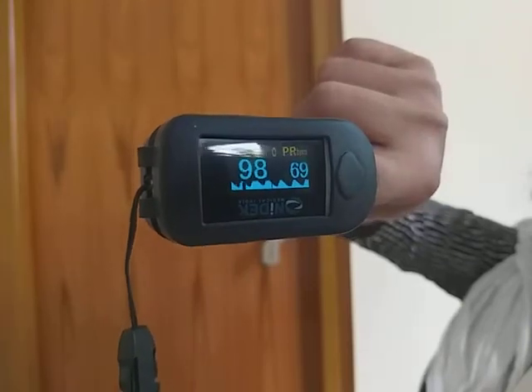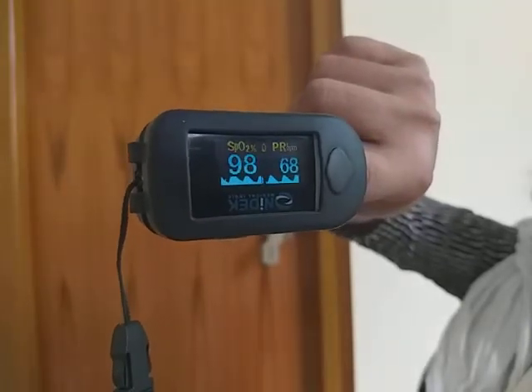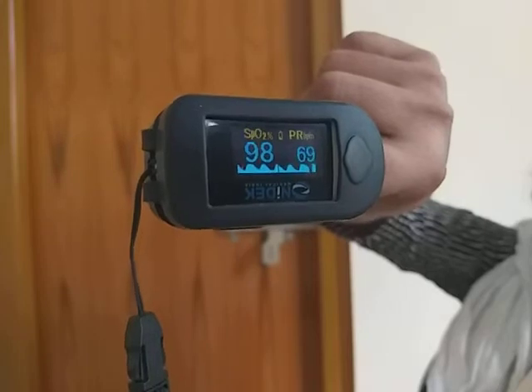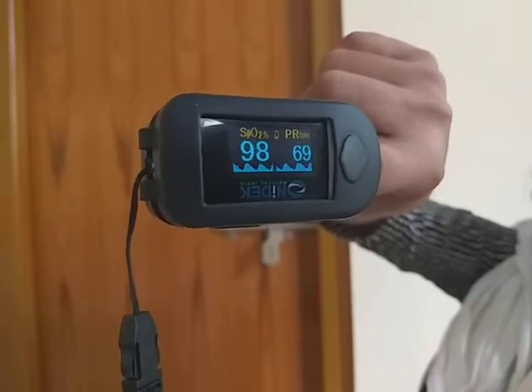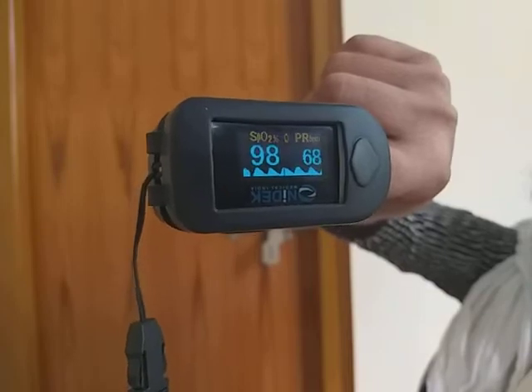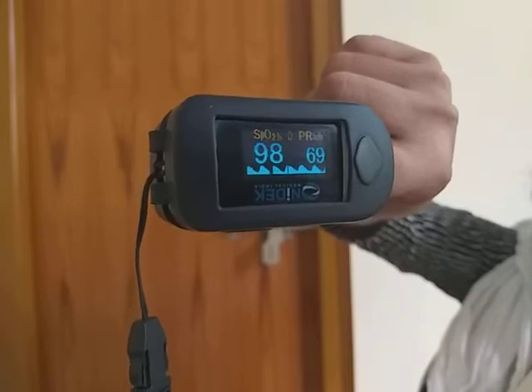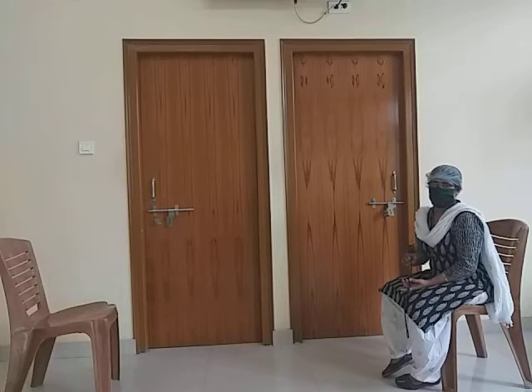I'm going to show you the two-chair test. You can see a pulse oximeter has been fitted to a finger and the pulse rate is 69 per minute. Saturation is 98%. I'll ask madam to just stand up from the chair and go to the other chair. You can see two chairs and madam is sitting over one.